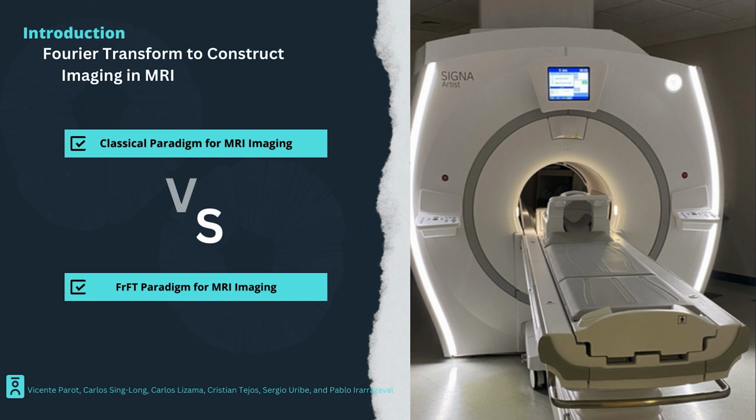Therefore, we propose the use of the fractional Fourier transform, FRFT, for analyzing and reconstructing the object's magnetizations under the presence of a quadratic field. The FRFT provides a precise theoretical framework which opens a new paradigm for understanding the MR signal which is generated by an object under a quadratic field.